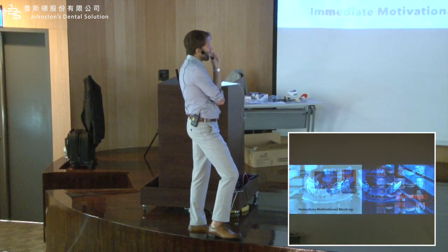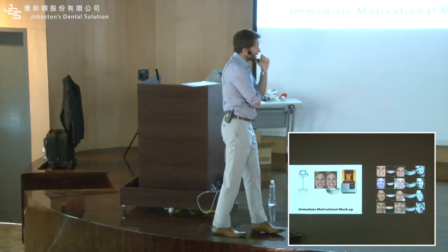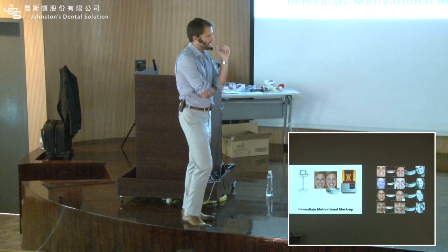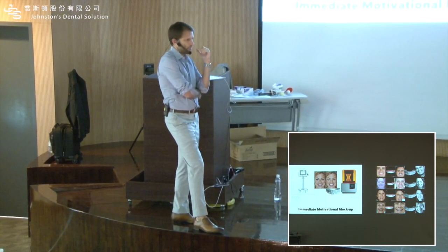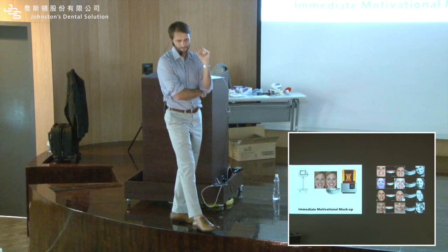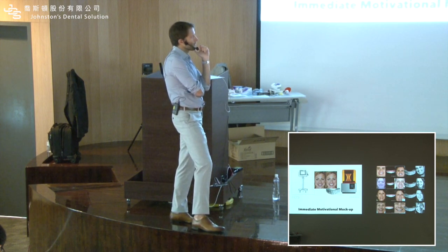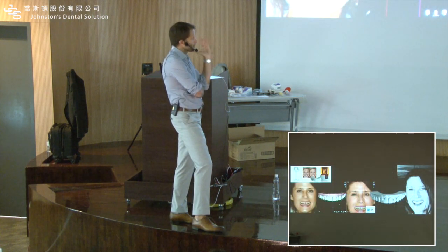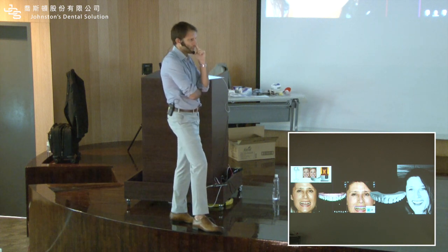Now when it comes to the mock-up, we've been doing this for 10 years. This process usually increases case acceptance from 50 to 70%. It really generates a completely different understanding from the patient, just the visual impact. Okay? So we do this every day, one patient after the other.